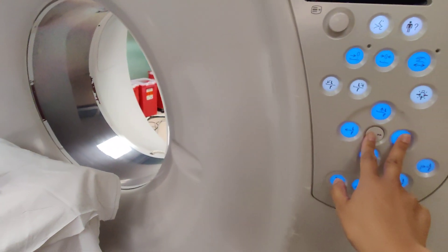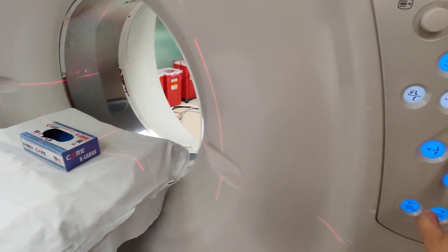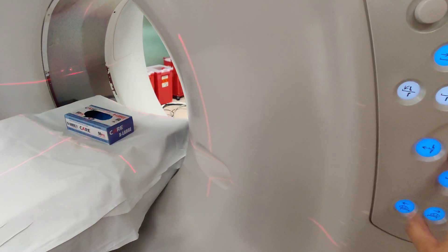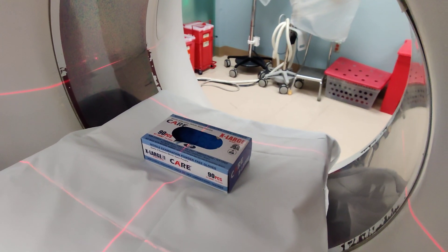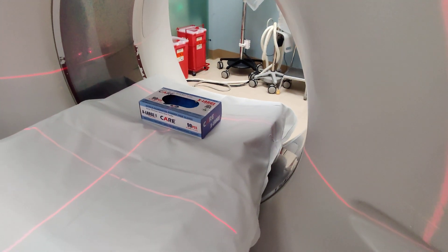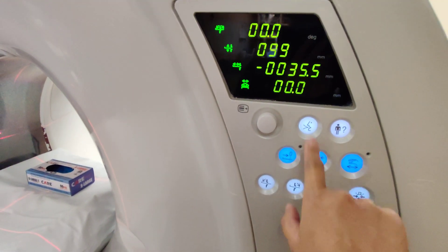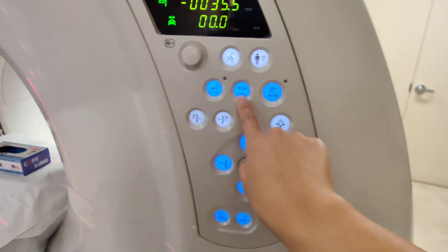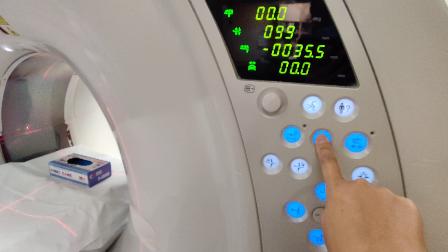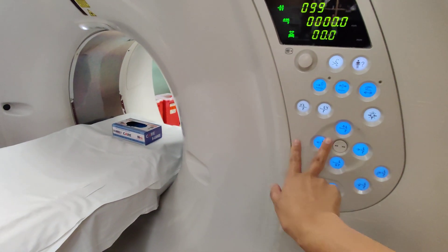What you do is go in, use your light — that's the toes right there. You're going to zero that out. That's the inside light. So right now you're going to zero it out. There it is. Now we're zeroed out, and you know you're at zero.